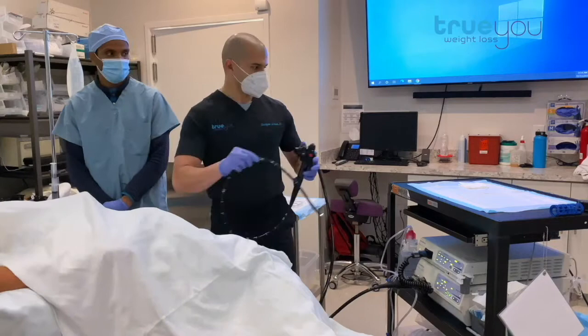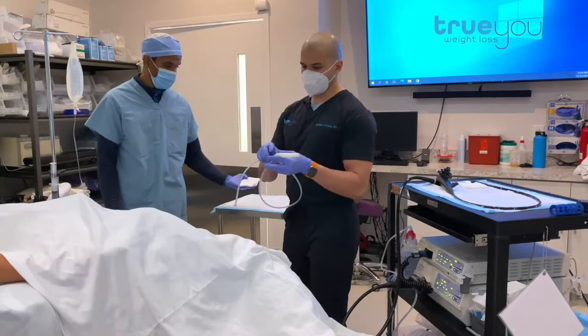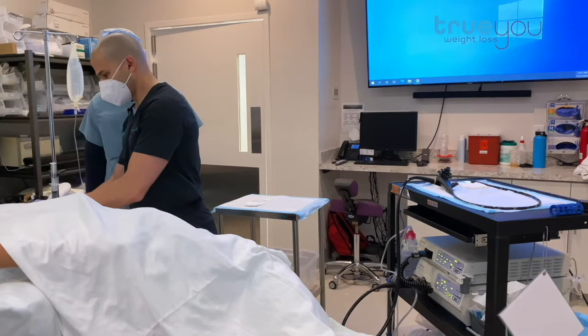The next step is to take our balloon, which is deflated, so it comes wrapped up. It's made out of silicone and we're going to fill it with saline. Here is the actual balloon in its deflated state. We'll just slide it right down the esophagus into the stomach. She's nice and comfortable and doesn't feel this in any way.